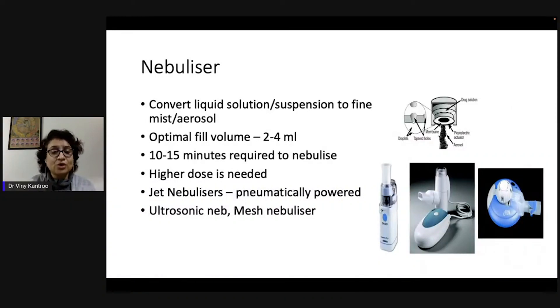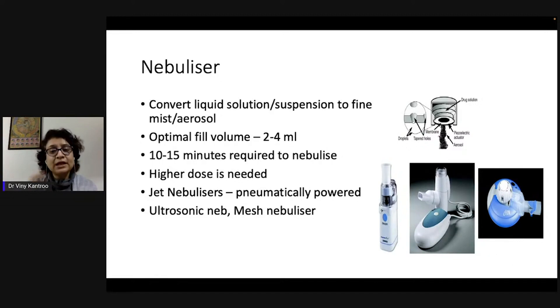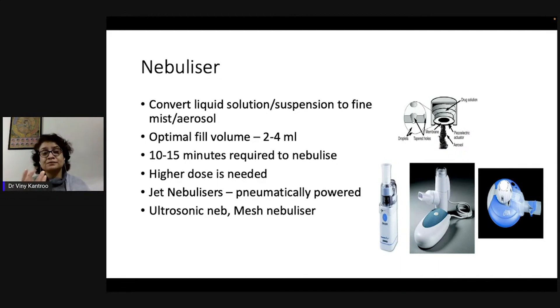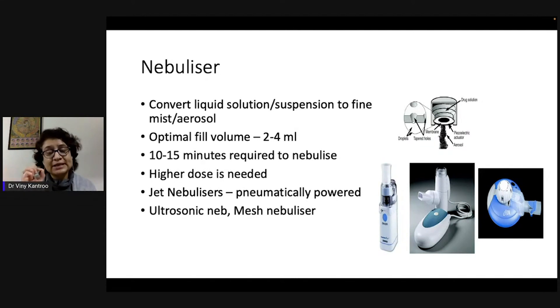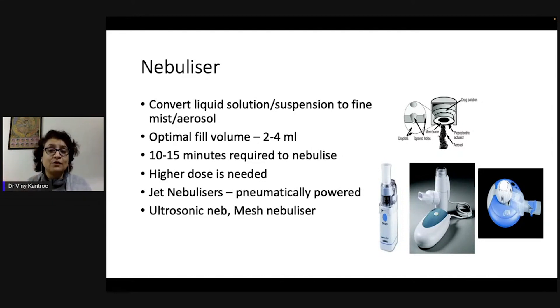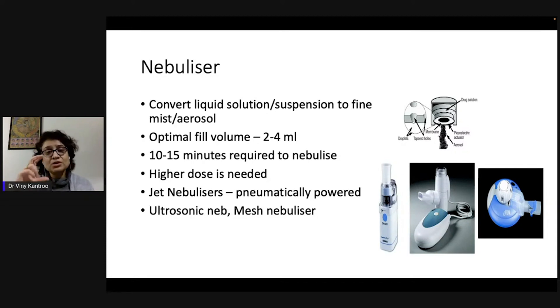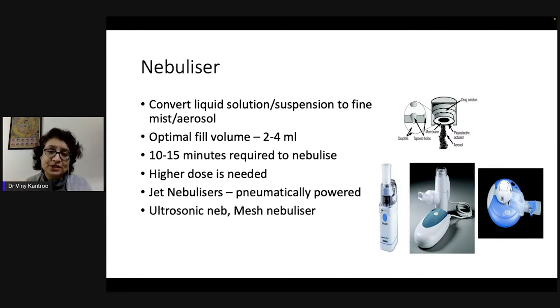Nebulizers convert a liquid solution or suspension into a fine mist or aerosol. The fill volume — the chamber provided for filling with the drug — should ideally be two to four ml, because there needs to be sufficient liquid to vibrate and break up into smaller liquid particles to be aerosolized as a suspension in air, enabling inhalation of the medication.